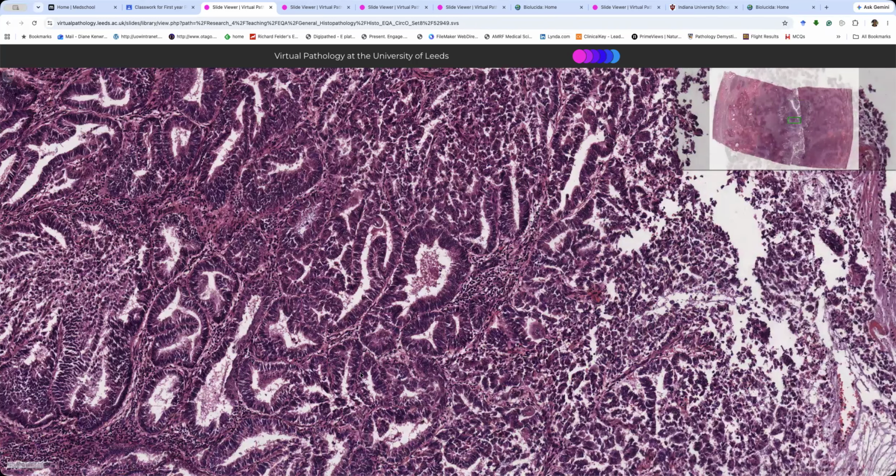Can you see it there? Barely a couple of bits of collagen between them. Yeah. Back to back. What does back to back mean? It means a couple of bits of collagen between them, just like a piece of string. So other people might say back to back glands. All right.